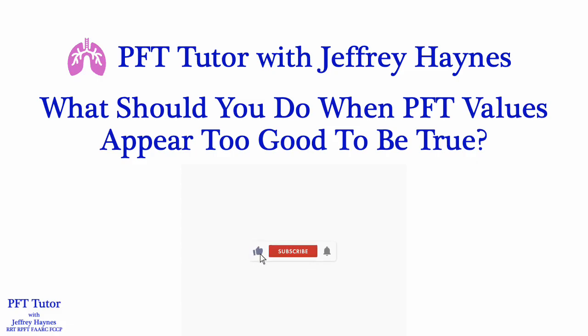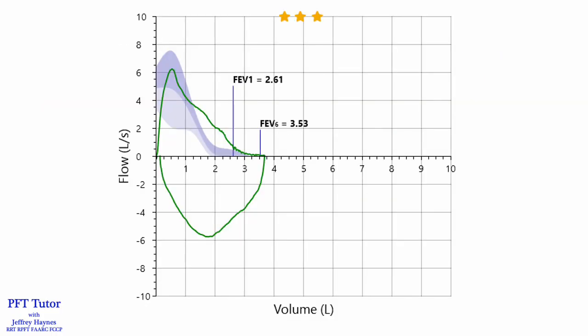It's greatly appreciated. In this video, we're going to discuss the actions you should take when PFT values have higher than expected z-scores and percent predicted. This case is about a patient undergoing spirometry testing, but the principles I'm going to review apply to other tests as well. This is the flow volume loop from a patient I tested, and it looks pretty good.